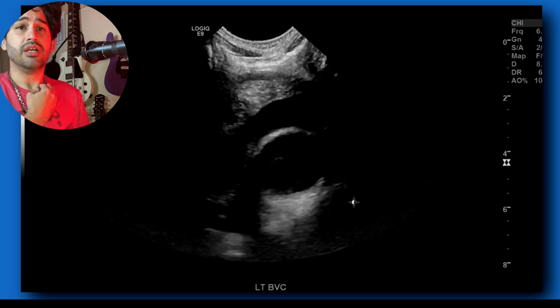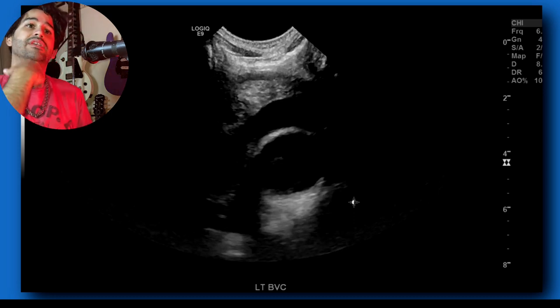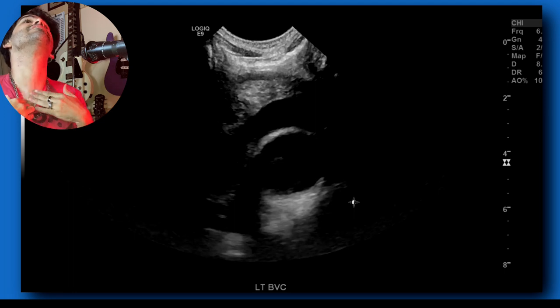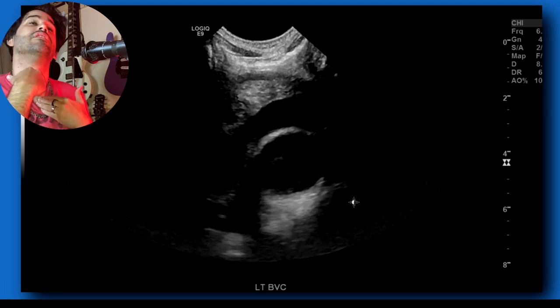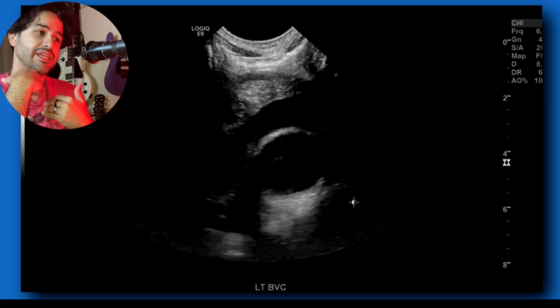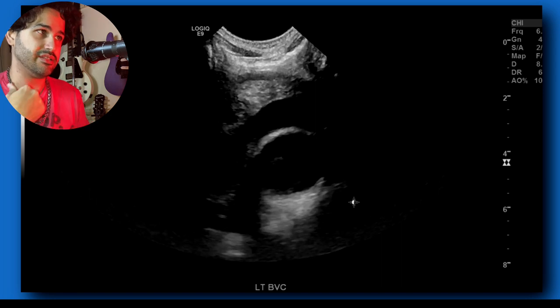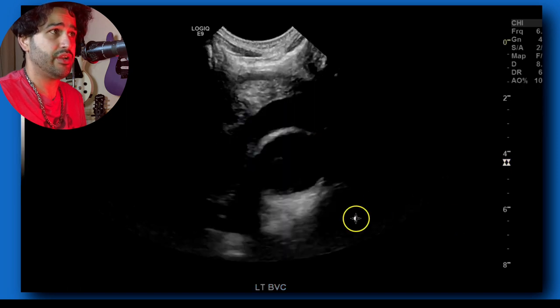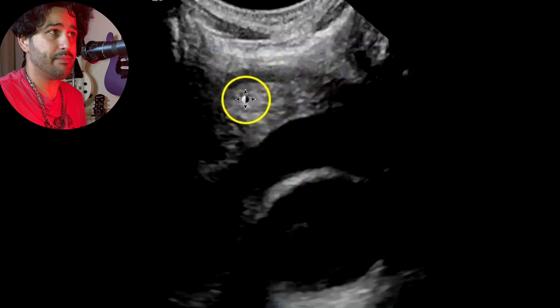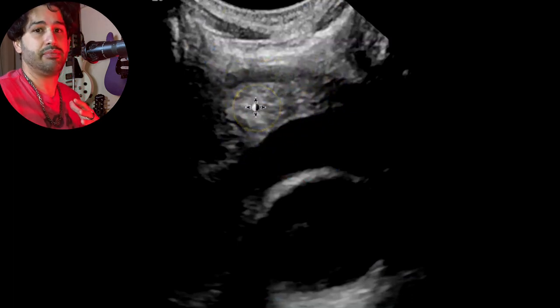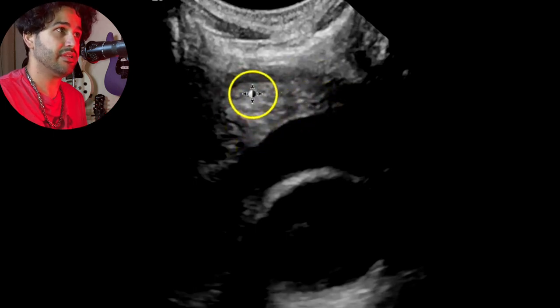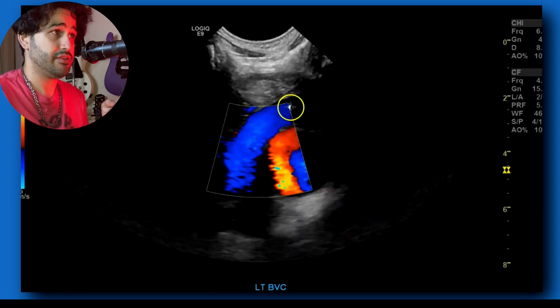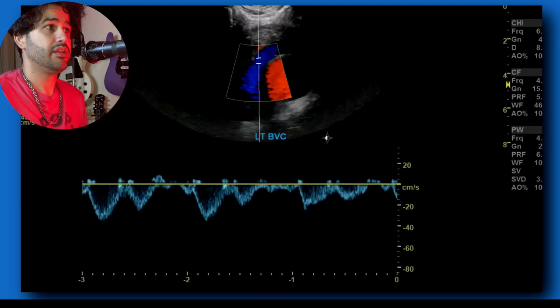Now the left brachiocephalic vein. If you're having trouble getting the brachiocephalic veins, you can scan from here. Have the patient turn their head or extend their neck — though sometimes extending the neck makes the area get very tight. Sometimes when they lean forward you have more give in the suprasternal notch. This echogenic part you see here is most likely thymus — very prominent in pediatrics, and you may or may not see it in adults. Left brachiocephalic vein without color, then with color, and then spectral doppler.